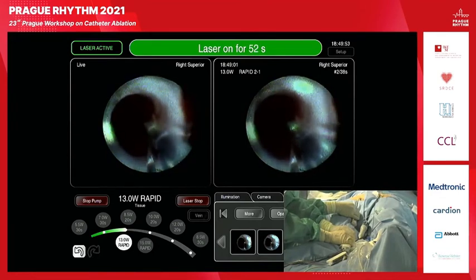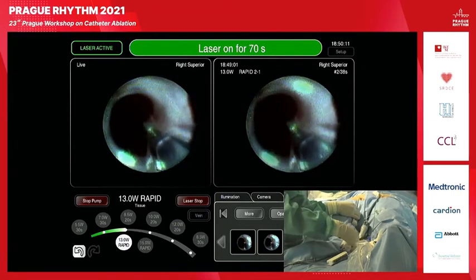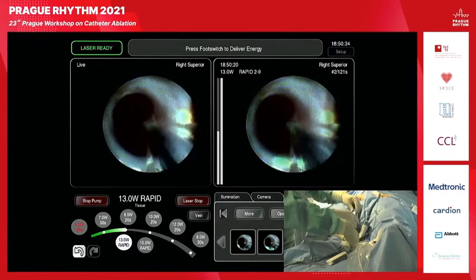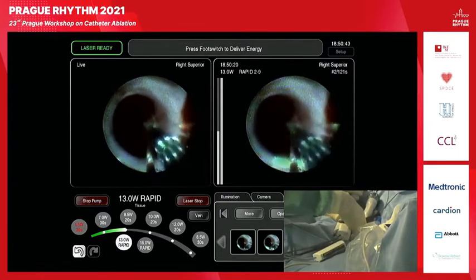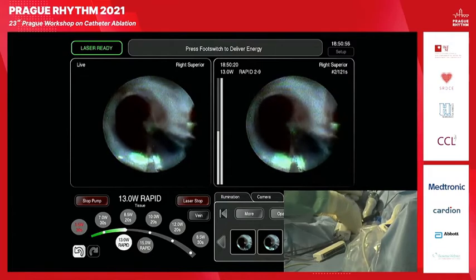But you can just see that the laser is coming on the anterior. We still have capture of the phrenic nerve, so we pass the superior part of the vein. It's coming to the bottom of the vein, and it's now like 62, 63 seconds on the second part of the application. And I hope we are going to be able to ablate under the shaft. So I will stop right now, and let's check where we are going with this beam. Okay, so I will go a little bit closer. Okay, let's see what we have here. Okay, so we can really go under the shaft. So I will stay here very close, and then I can just by the button manipulate the proximal and distal position of the laser beam. Okay, so let's continue with 13.